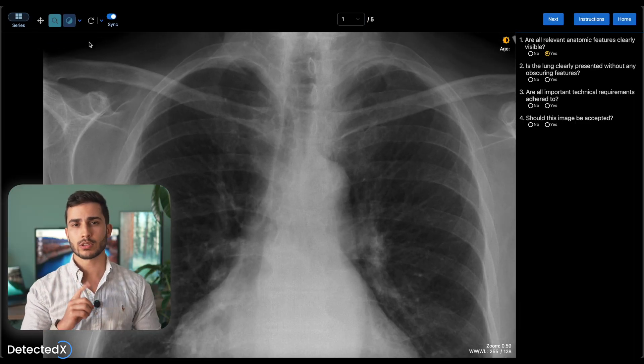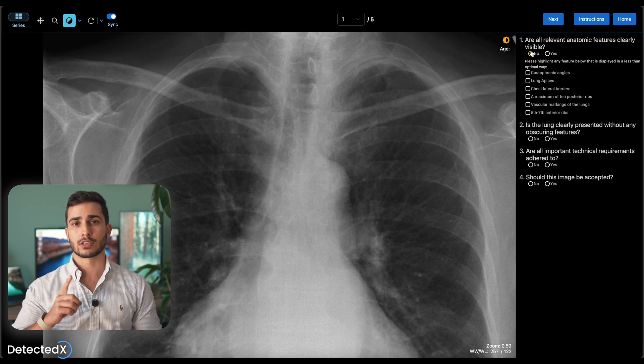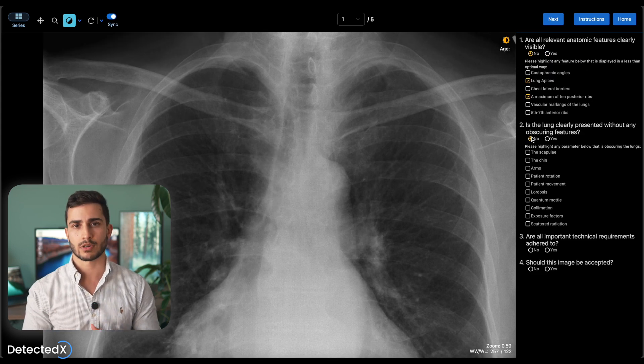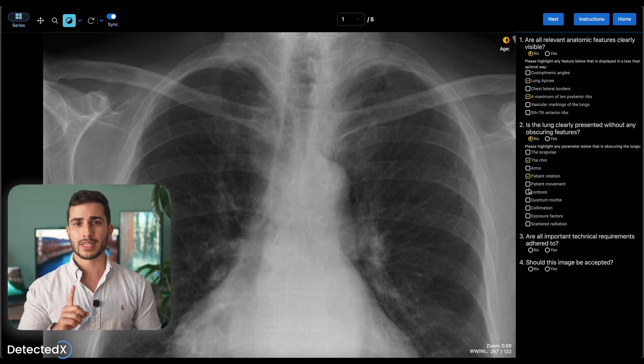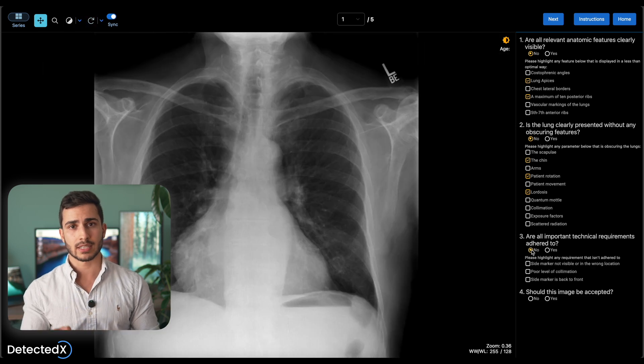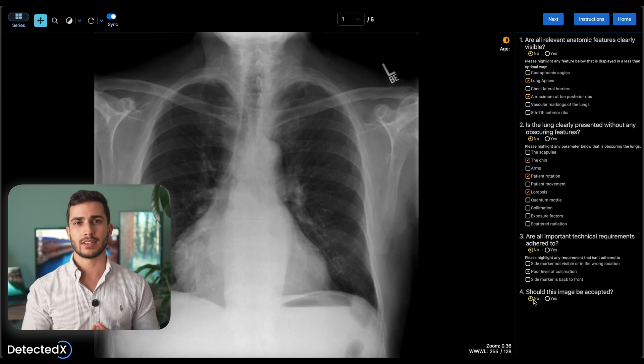In the fifth module we take all that you've learnt and use that to critique the quality of some poorly taken radiographs, so you'll be able to know how to correct their positioning and technique just by looking at the x-ray.